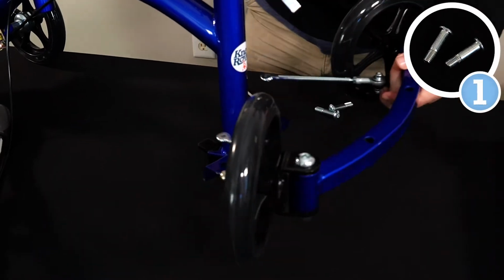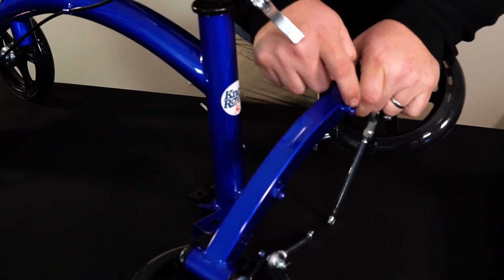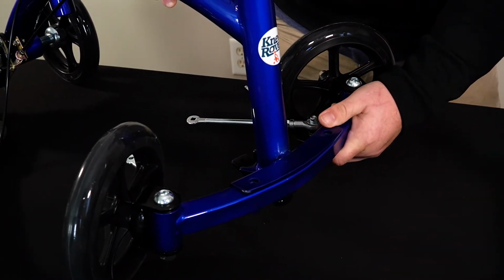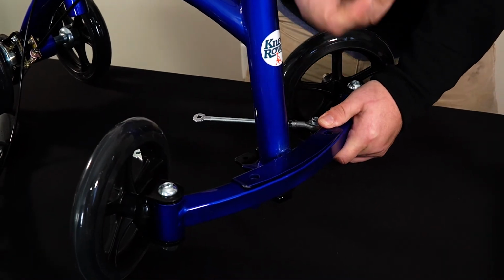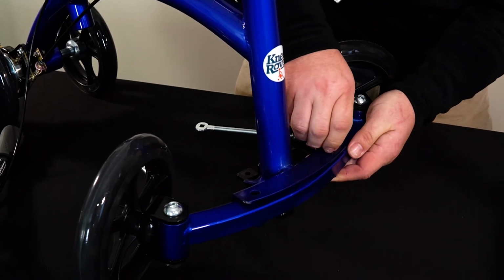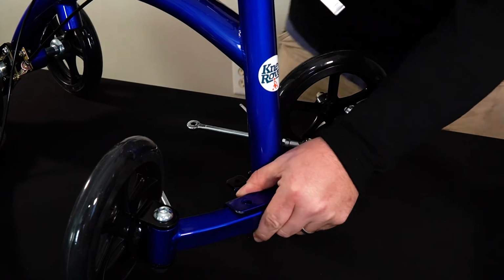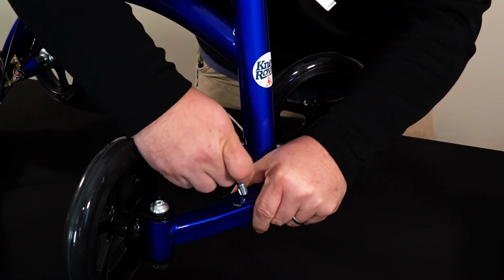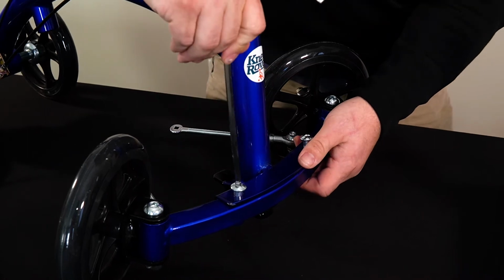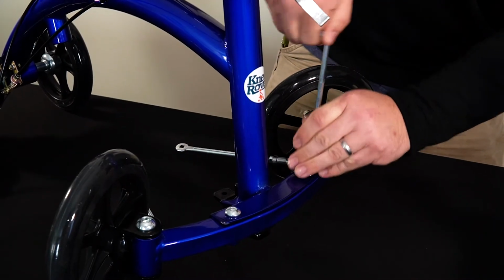All right, so we're going to put this front axle on for step number 1. What you're going to do is make sure that these welded on nuts right here are pointed towards the bottom. You're going to sit that on just like that. You're going to take your big bolts, put them in and line them up with the nuts underneath. And you're going to take your Allen wrench and start screwing it in. And just make sure you get them really good and snug.